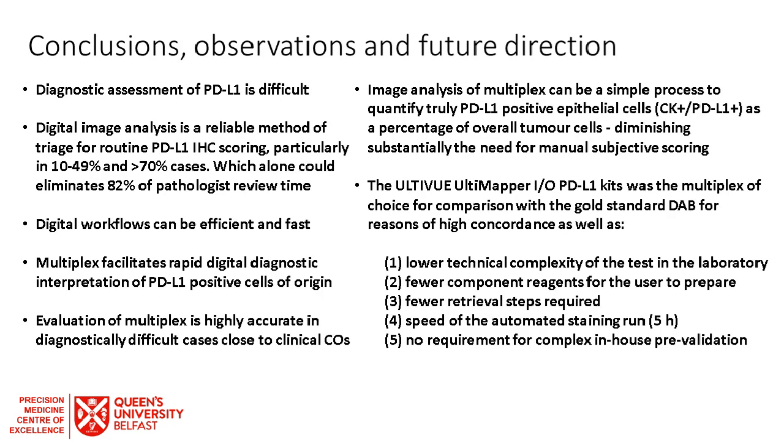So to conclude, I hope that I've shown you that the diagnostic assessment of PD-L1 is extremely difficult, but digital image analysis can be a reliable method of case triage, especially when you're not around these clinical thresholds, which alone can save a massive amount of pathologist review time. Hopefully I've shown you that digital workflows can be fast and efficient, and that multiplex facilitates this rapid digital diagnostic interpretation, and it's highly accurate. It can be a simple process to be able to quantify truly positive epithelial cells within the sample, and really does diminish the need for this subjective manual scoring.